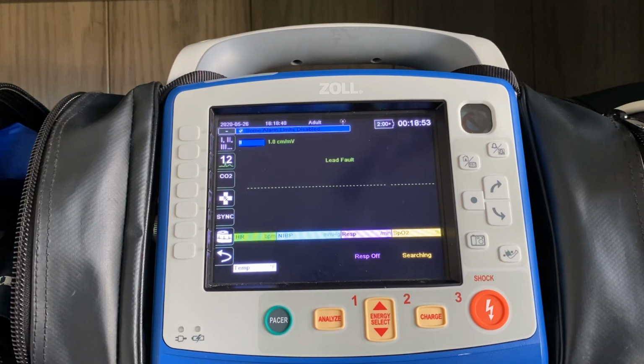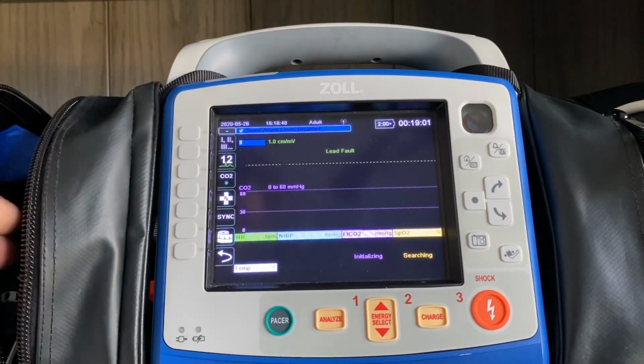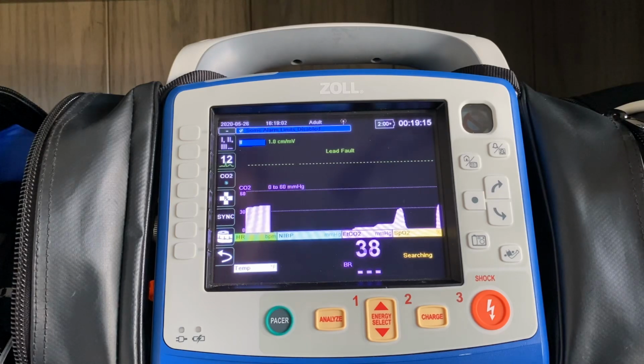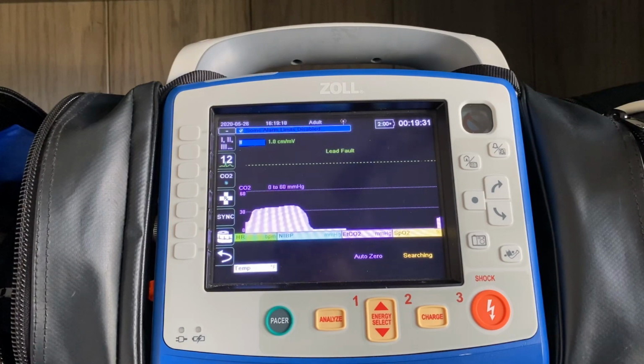The process is exactly the same. So you hit the CO2 button. Plug in your disposable piece. And I'll take a couple breaths here, you can see. So those nice flat plateaued waveforms are what we're shooting for.